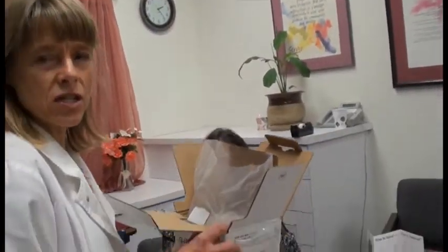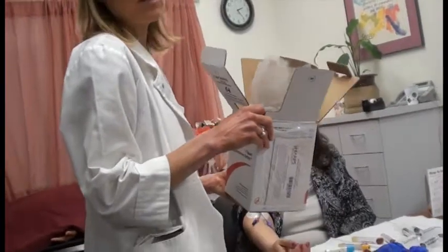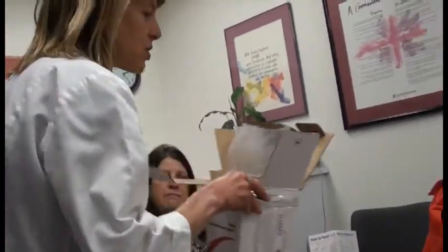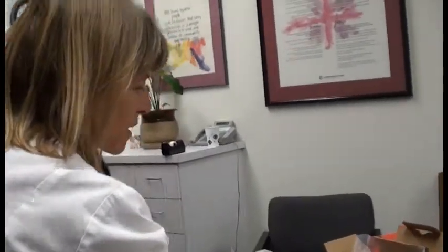First thing you need for any lab draw, obviously, is an order. So check and make sure you have the order. The second thing you might need would be the gear. So for lab draw gear, don't forget the sharps container. If you don't have a patient that's an infusion patient, you will have to bring in your own sharps container from your car. We don't want staff to take syringes full of blood to their cars and drop them in the back seat. Laying around there would not be a good idea. So make sure you have your sharps container.